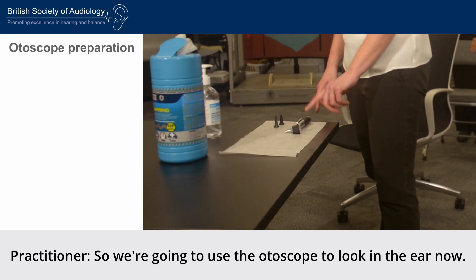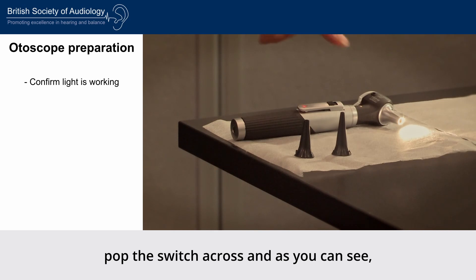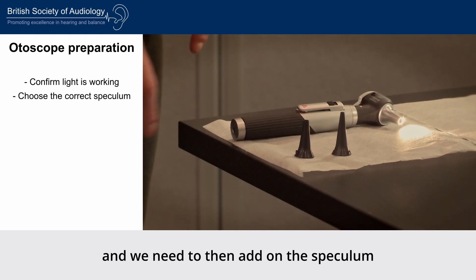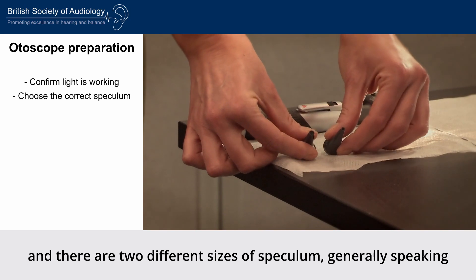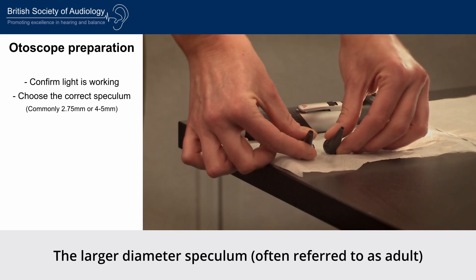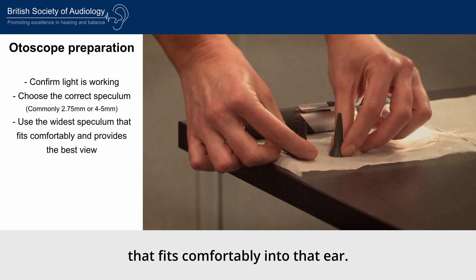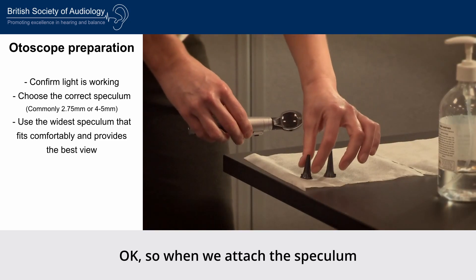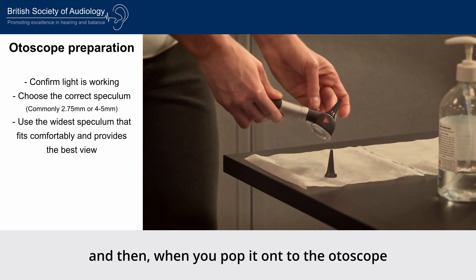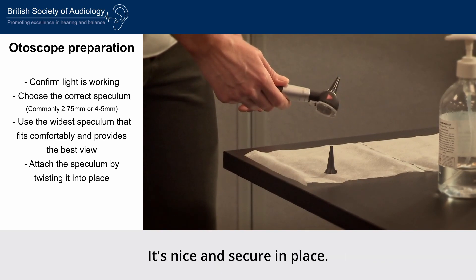To switch the otoscope on, pop the switch across and the light will activate. We then need to add the speculum. There are two different sizes of speculum, and for an average adult ear you want to use the widest speculum that fits comfortably into that ear. Pick up the speculum, place it onto the otoscope and twist it round into position so that when you turn it over it doesn't fall off — it should be nice and secure.